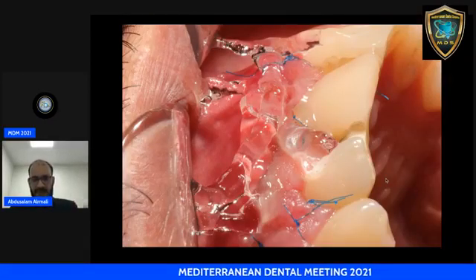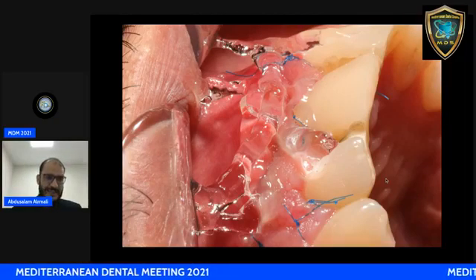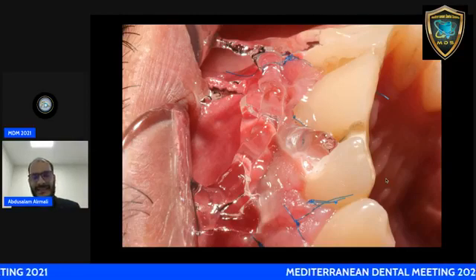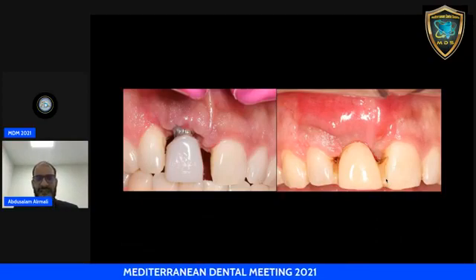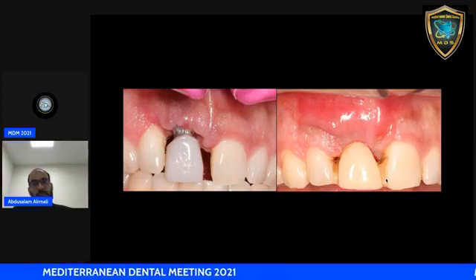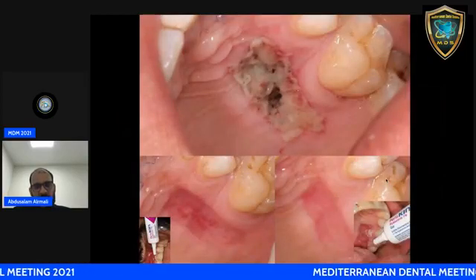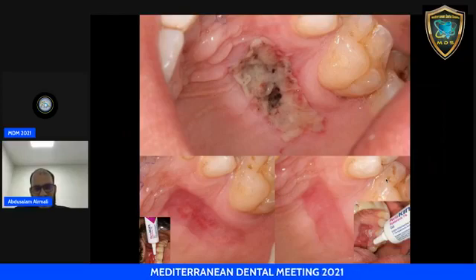And we apply the periocan gel, a hyaluronic acid gel, in most of the cases to improve and accelerate the healing. And this is before and after. This is before the intervention, and this is 2 months from the intervention, and we try to deliver finally the final crown after some time. And this is the healing of the palate by adding some hyaluronic acid to improve the healing.